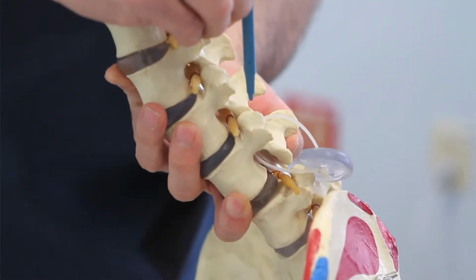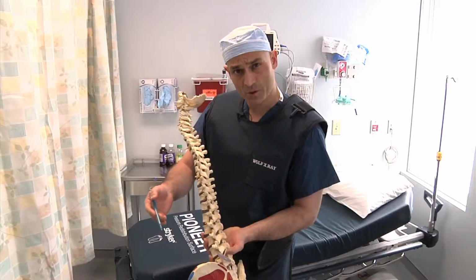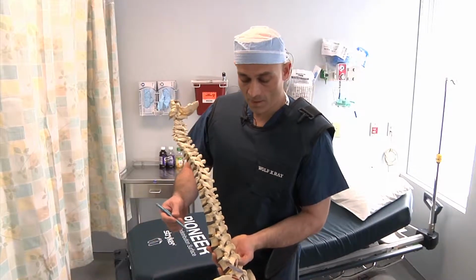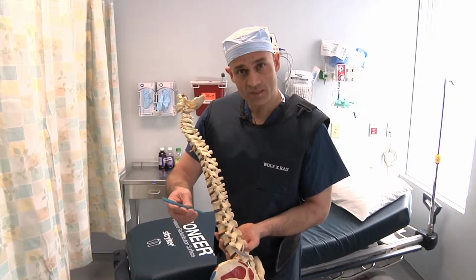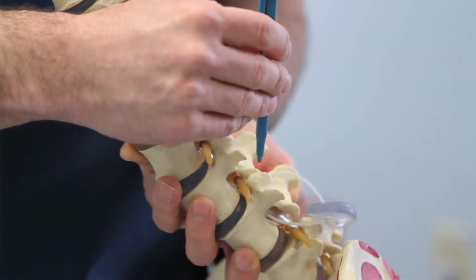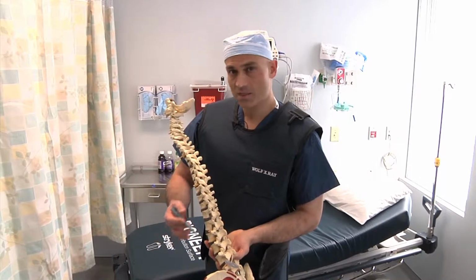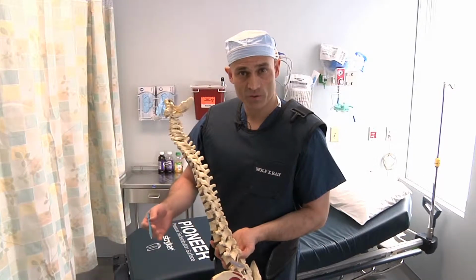These are the small joints in the back of the spine which provide some stability and motion, but which are prone to degeneration and can lead to the onset of back and sometimes leg pain. And the procedure that we're going to carry out today involves the insertion of a very small needle under fluoroscopic guidance into the joint. Once the needle is in the joint, some contrast material is injected to identify and delineate the anatomical regions of the joint.